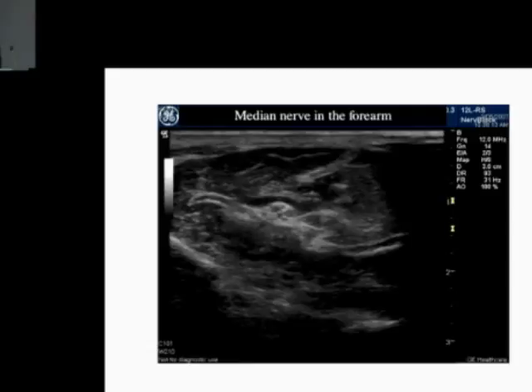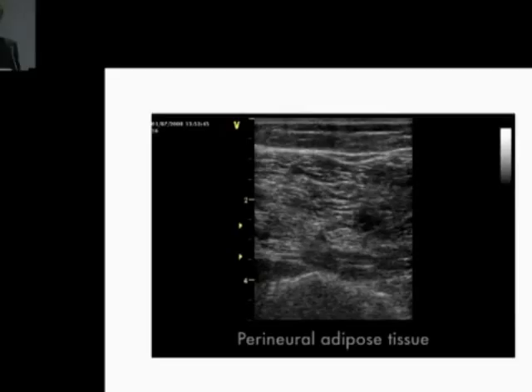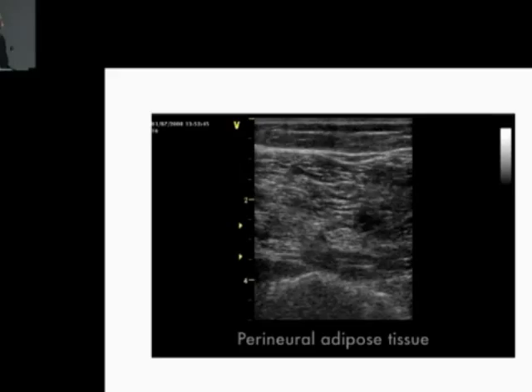Perineural adipose tissue sometimes gives us a clue. In the popliteal fossa, there is often a slight hypoechoic halo surrounding the sciatic nerve due to adipose tissue, which confirms that the structure in the middle is the nerve. It can almost look like local anesthetic has already been injected.